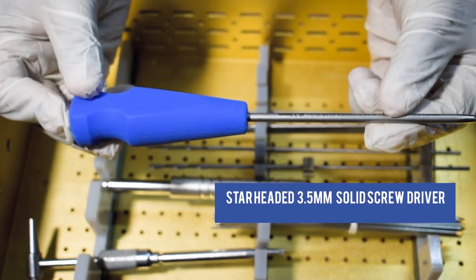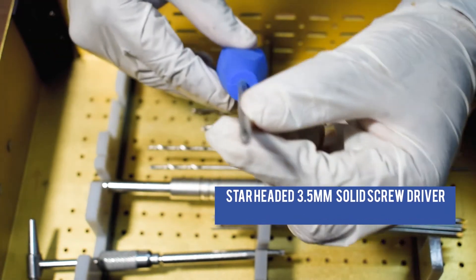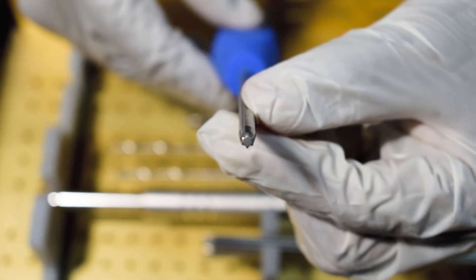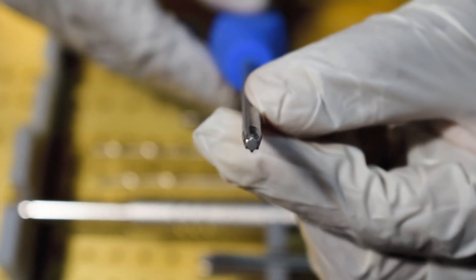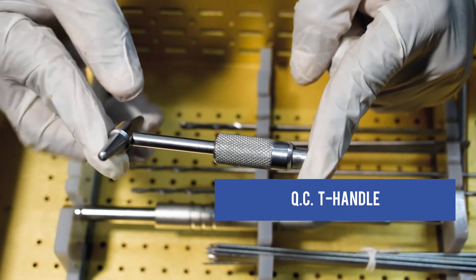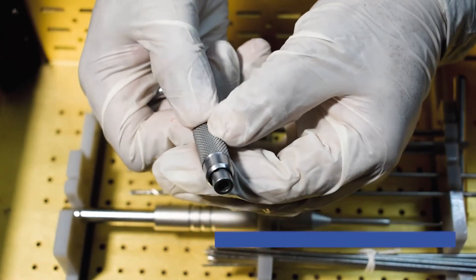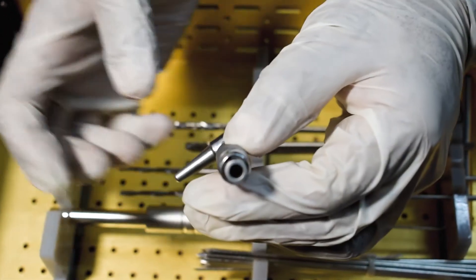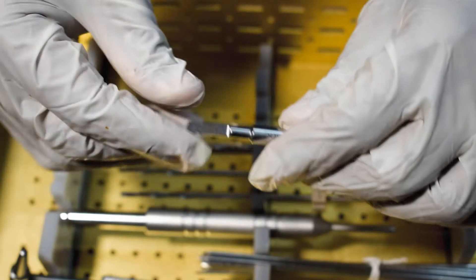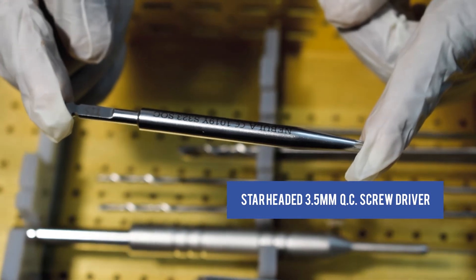This is the 3.5mm Solid Screw Driver, Star Headed with Silicon Handle. This is the Quick Coupling T Handle. This is the 3.5mm Star Headed Quick Coupling Screw Driver.